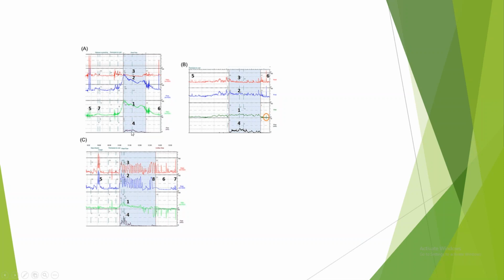So there are two points in this. When we see a graph like that, it might be due to hypocontractility. In hypocontractility, you see here also it is slow emptying, but here detrusor pressure is very low. Got it? In the second graph, detrusor pressure is very low, so it might be due to detrusor hypocontractility. But in this case, detrusor pressure is very high, so she might be straining, or she is trying to overcome this obstruction. So it might be due to bladder outflow obstruction.